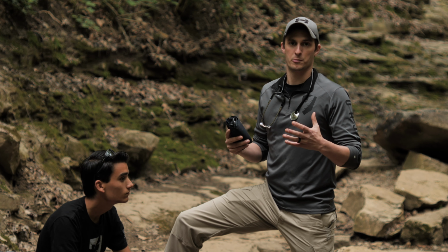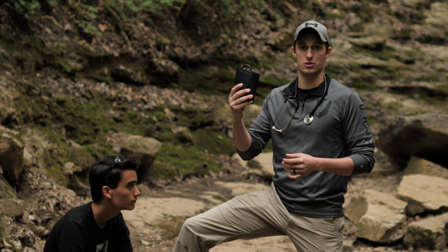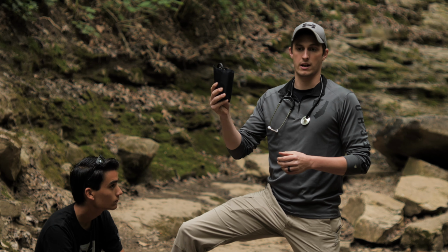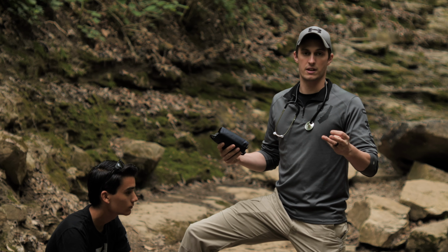So first off, let's go over the typical way with a blood pressure cuff and a stethoscope. When we are taking a blood pressure, we have two pieces of equipment that we need to use. We have the actual blood pressure cuff, and then we have a stethoscope. We're going to use the stethoscope to listen to the pulse to determine what the pressure is that we're reading on the blood pressure cuff. So I'll run you through this and show you how to do it.